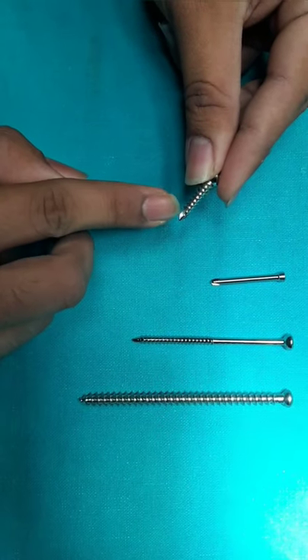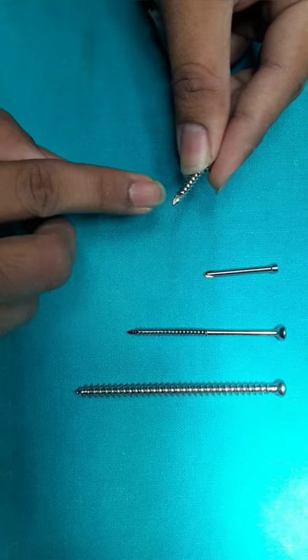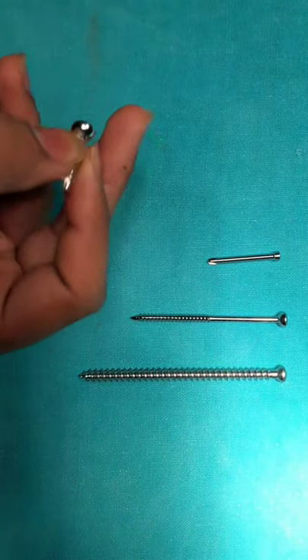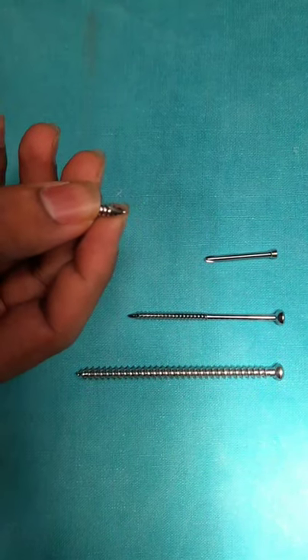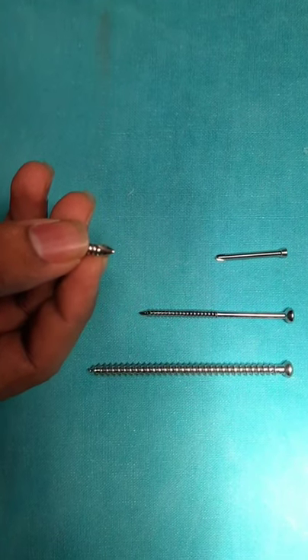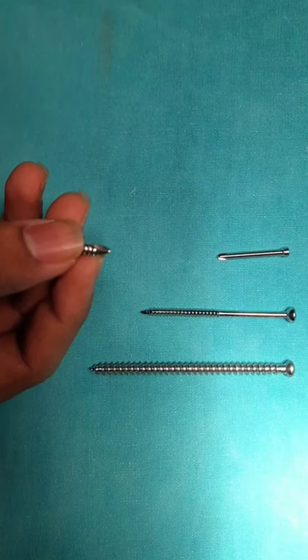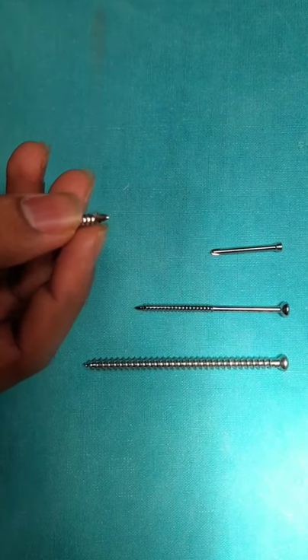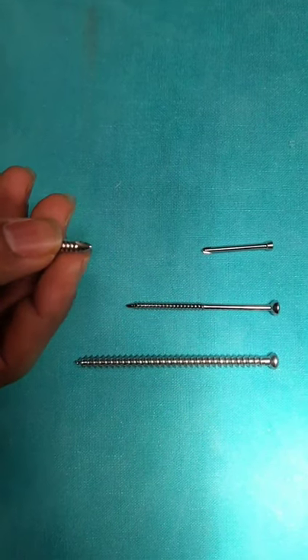This is a self-tapping tip where there is a flute in it. It cuts threads into the bone as the screw advances. Self-tapping screws need a pilot hole. The length of the screw should be selected so that the entire flute segment protrudes beyond the distal cortex.